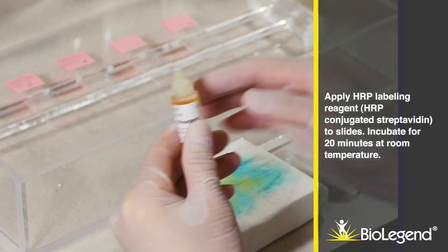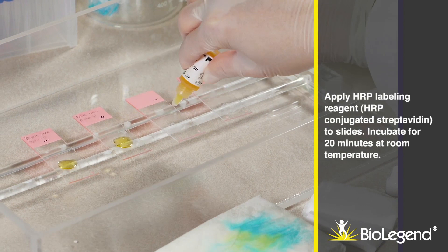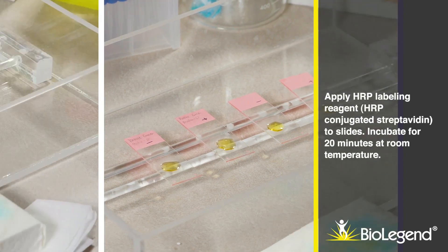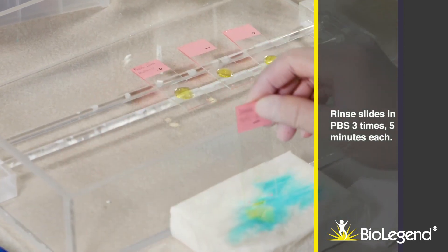Apply HRP labeling reagent, HRP-conjugated streptavidin, to the slides. Incubate for 20 minutes at room temperature. Rinse slides in PBS three times, five minutes each.